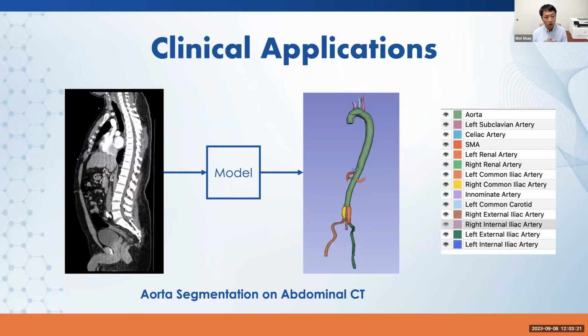For example, you can use image segmentation to segment a region of interest for further analysis. Say, if I want to calculate the volume of a certain organ, by segmentation you get the volume of your organ, and also you get the shape. For example, I will give an example of 3D segmentation.